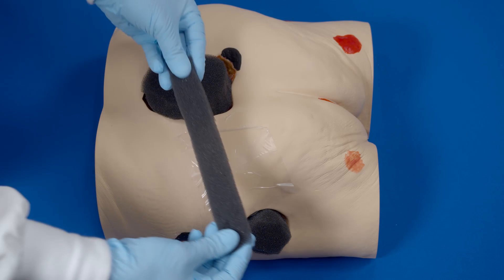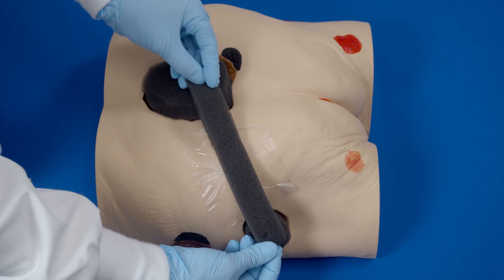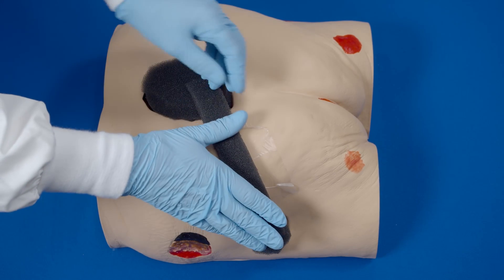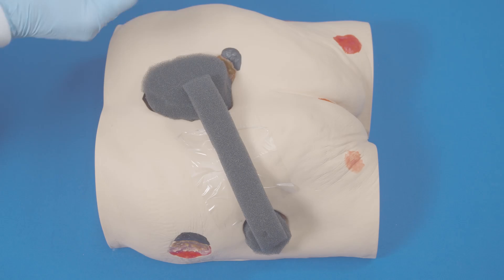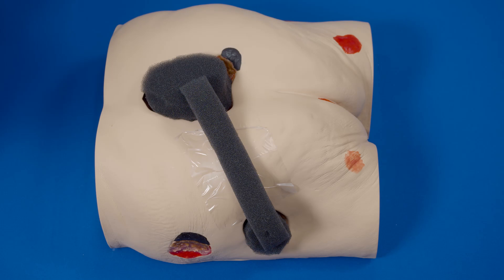Apply the bridge on the transparent film between the two wounds. Ensure it has good contact with the foam in the wound and has no contact with skin that is not protected.